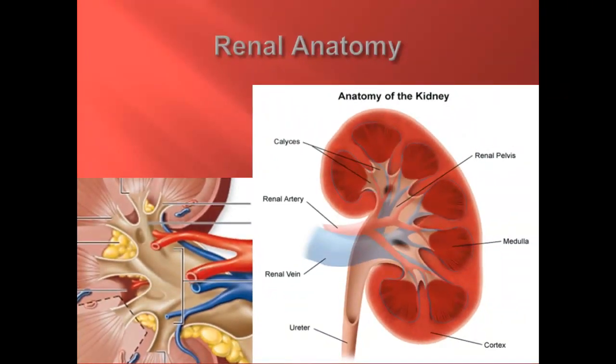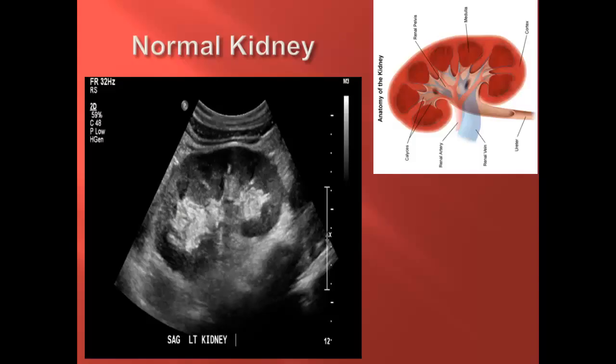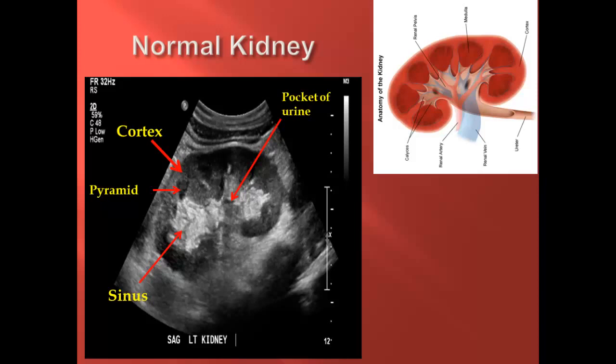Please take a moment to familiarize yourself with the components of normal renal anatomy. Here we have a sonographic representation of a normal left kidney in the sagittal plane. A simplified schematic is provided in the upper right corner for comparison. You can appreciate that the renal cortex is of similar echogenicity to the adjacent liver or spleen, and that the fluid-filled medullary pyramids are demonstrated in a regular arrangement around the sinus. The central echoes from the renal sinus are hyperechoic or bright due to fat content and the sinus is appropriately collapsed and homogenous in the absence of obstruction. Note that one can normally see small, dark pockets of urine within the bright sinus, and that the ureter is often obscured by bowel gas and not visible on ultrasound unless dilated.